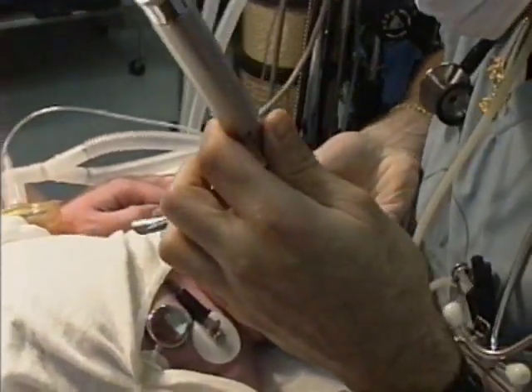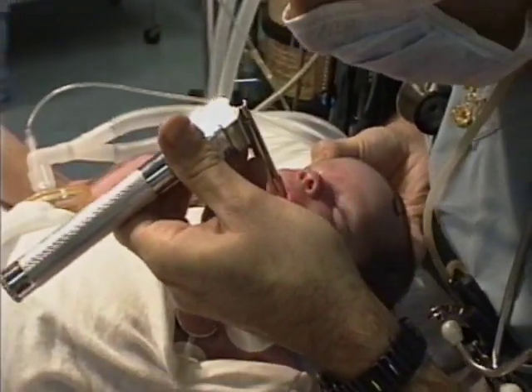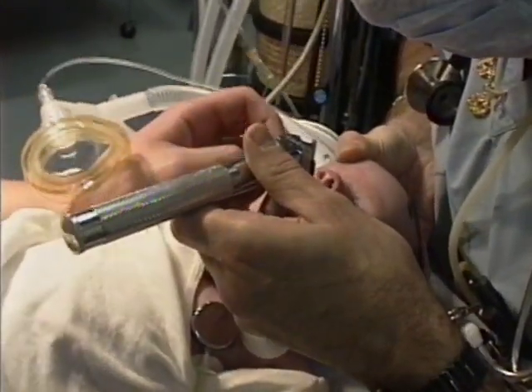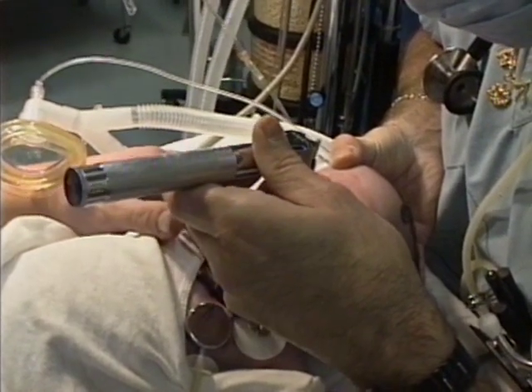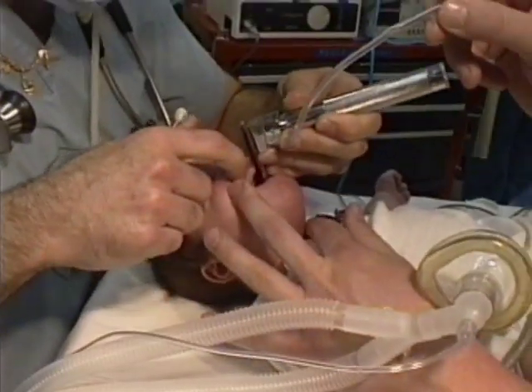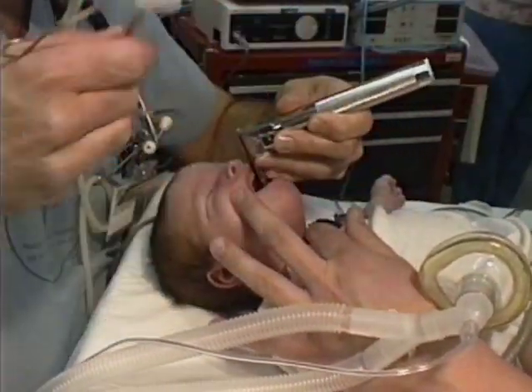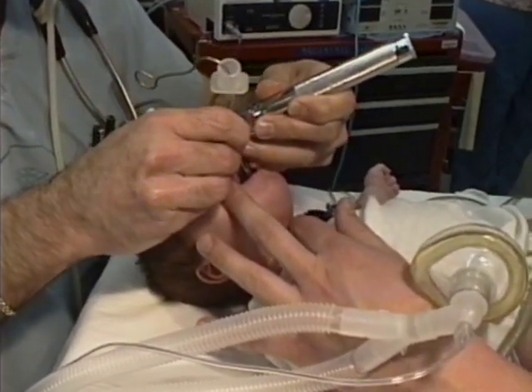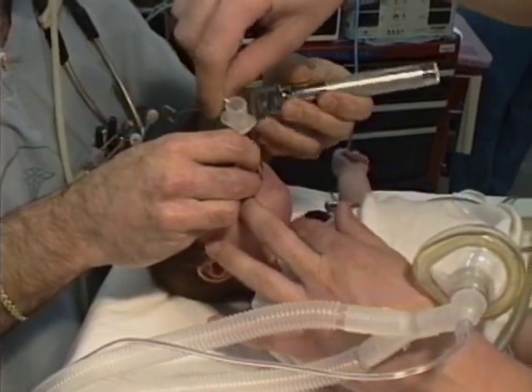In a child younger than about 8, the smallest diameter of the airway is the cricoid ring. A properly sized round endotracheal tube will seal this round cricoid opening, and using an uncuffed tube allows us to use a slightly larger size and therefore avoid higher resistance to breathing.